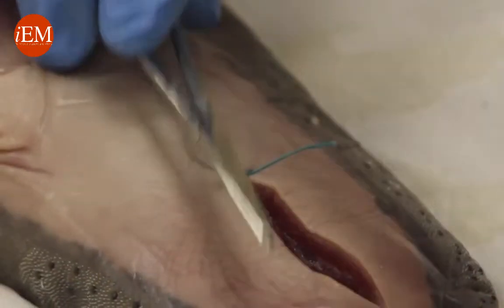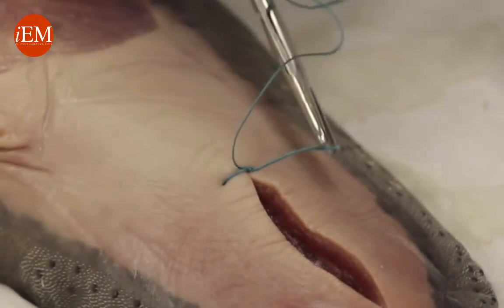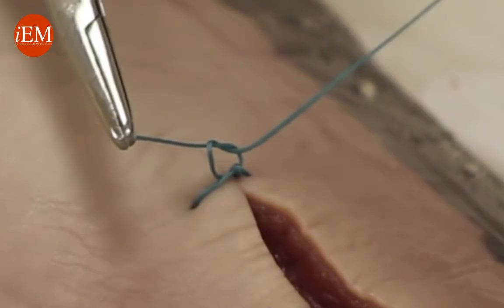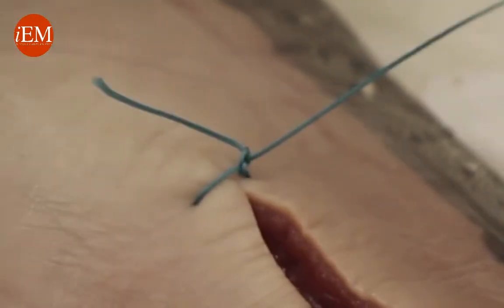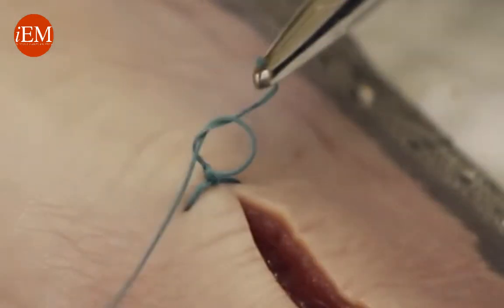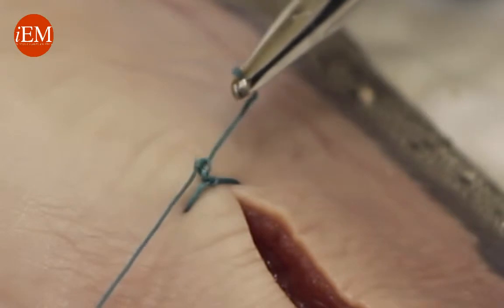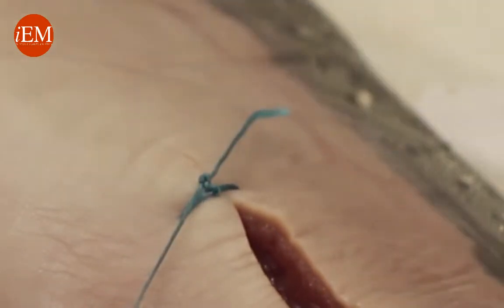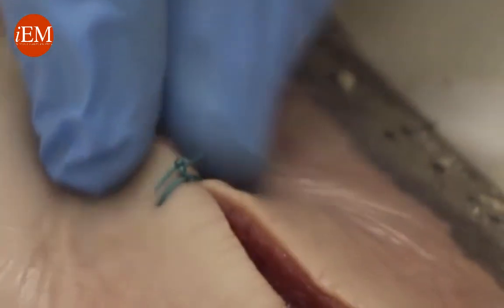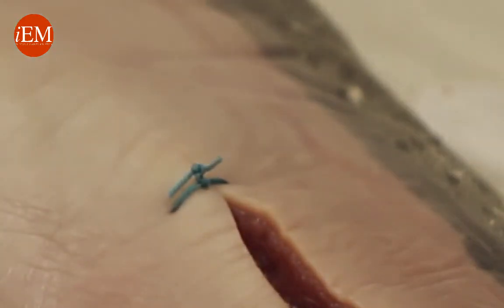Now I convert it to a square knot: put the driver in between, wrap it once, and you see how I come down flat. Again, put it in between and come down flat — and that's the end of my slipknot. Then I square them and I've got exactly the tension that I need on the skin: not too tight and not too loose.